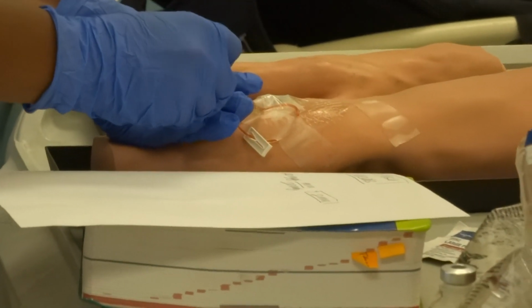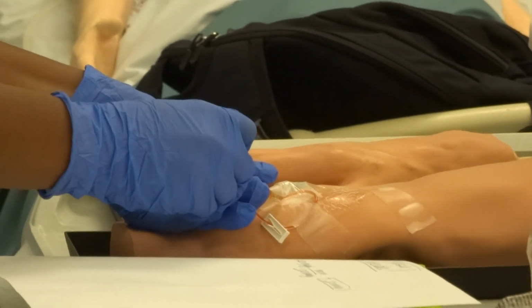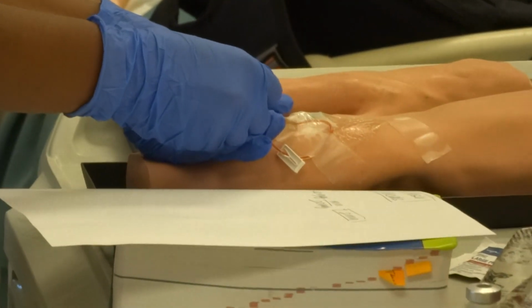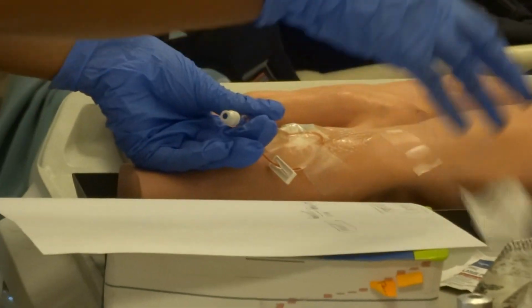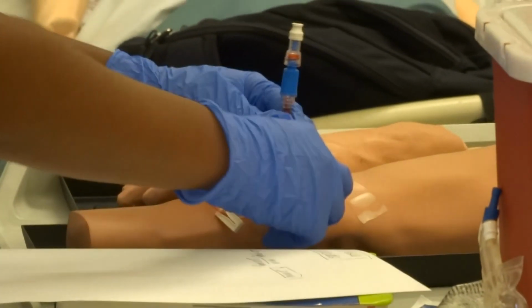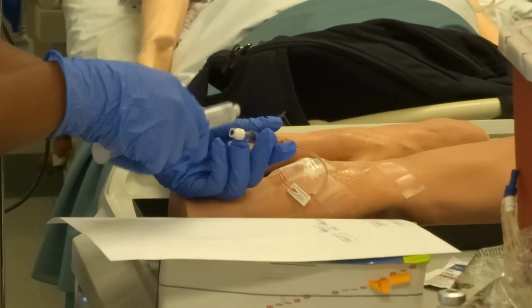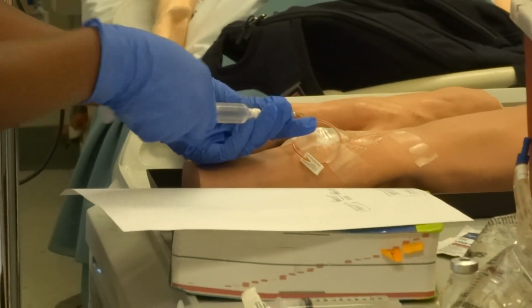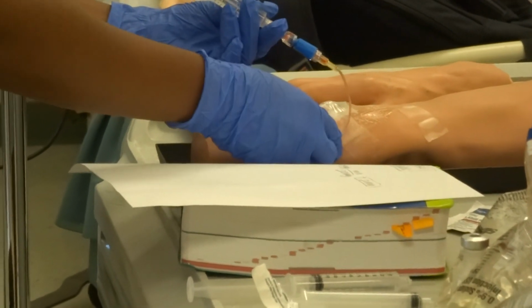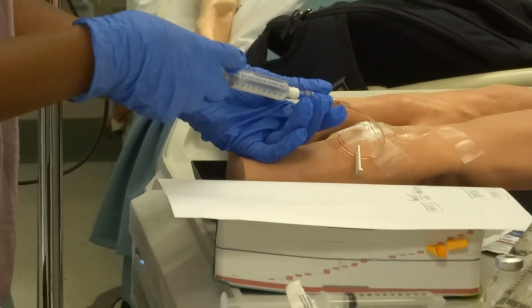So actually what I did, which went really fast, is you have to scrub for 20 seconds. That's the rule for competency, and it should be the same in the hospital, but some nurses will do it like that and then go away. That's not good. Scrub for 20 seconds, and then open up your normal saline, attach that, and I should make sure that this is open, right? Pushing, and then nothing's going in, that's not good either.